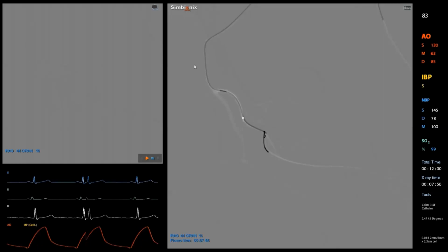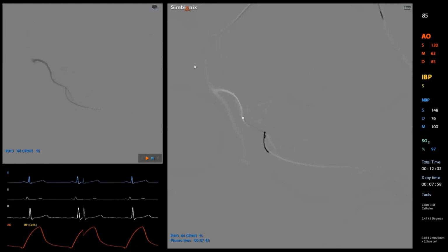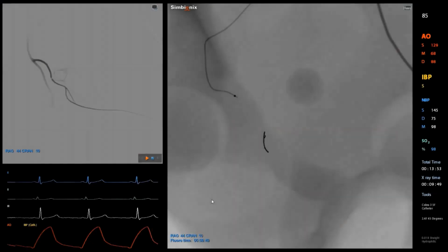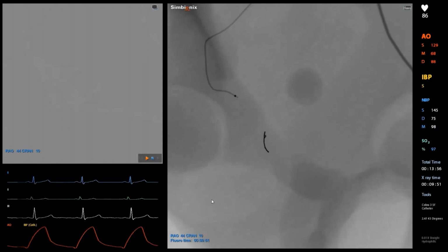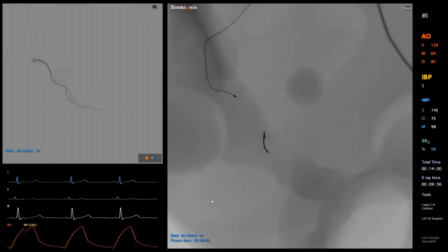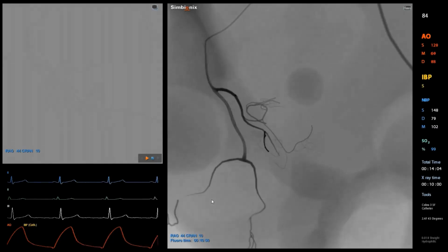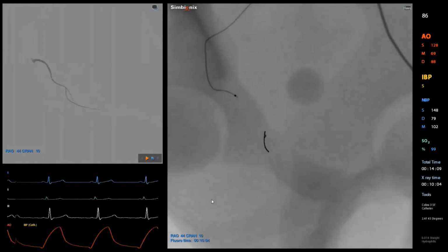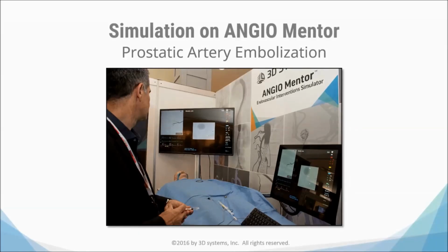You have blocked any non-target embolization vessel, and you are able to do your embolization in a safe position. So inject very slowly, and once you have injected your embolic agents, you get a control and you finish your case. If you have used the Foley balloon only as a guide for the procedure, do not forget to remove the Foley after the procedure.